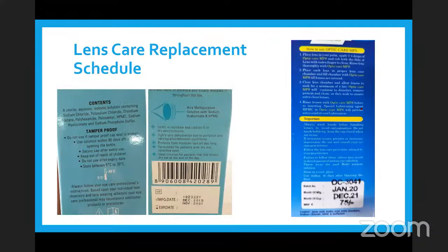The next query or question which people normally have is the lens care replacement schedule. So the first was the lens replacement: how should I replace the lens? This one is the lens care replacement schedule. There are two things you need to understand. There are two expiry dates on the solution, right?